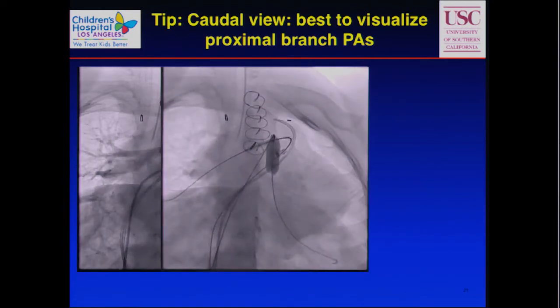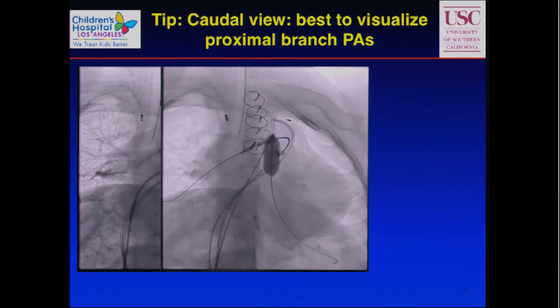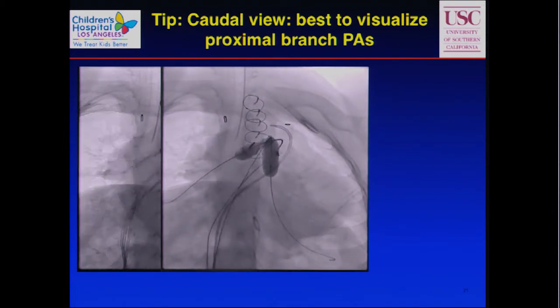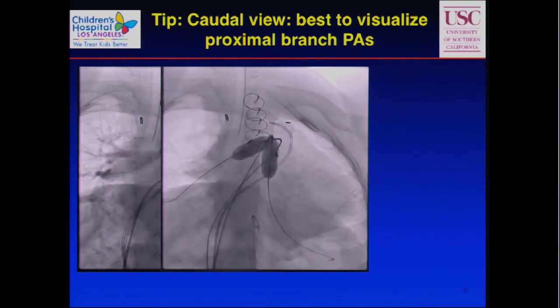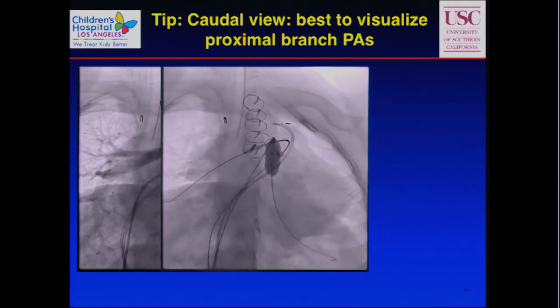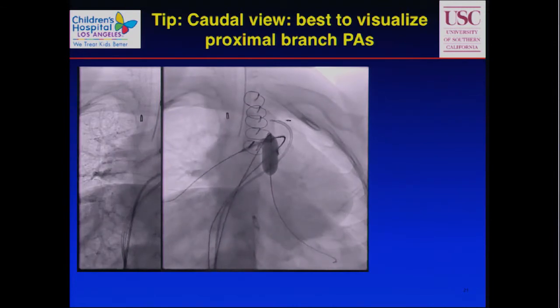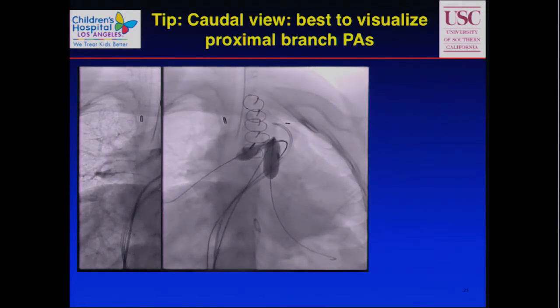And so, of course, you can do one thing. You can put a stent in first. Now, you see that there's wires to both sides. There's a sheath to both sides. In fact, there's a stent in both sides. But you don't have to go simultaneously. You can go with one first, and then with the balloon up, have your second operator inflate the second one. Of course, when both balloons are up, you're blocking things completely. But at least you buy yourself a few extra seconds by going one first.